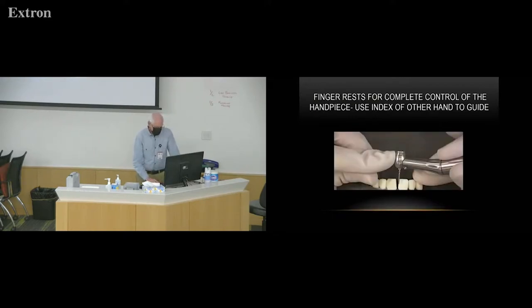Just a quick review. You're holding the handpiece in one hand and you're using your thumb and index and third finger. And then you're going to use a rest with your other hand to control that handpiece. So you have the luxury of two hands on the handpiece in this procedure.